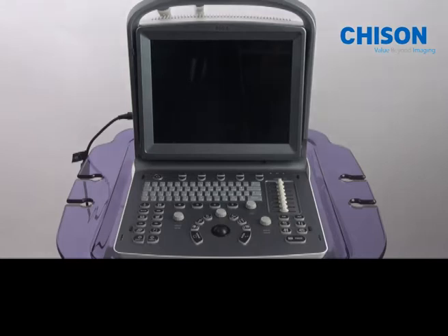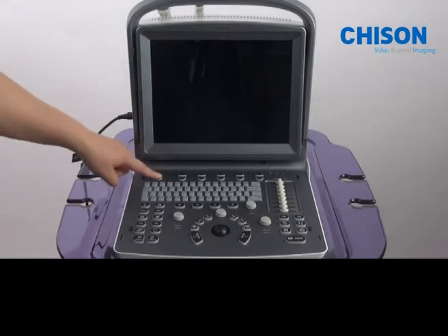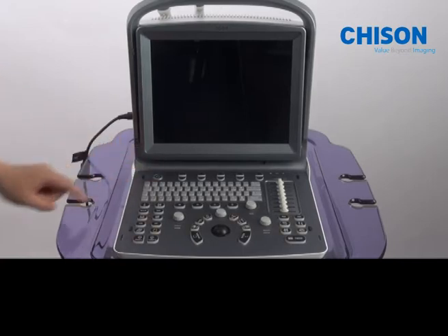Thanks for choosing CHISON ECO6. Now we are going to give you an operation training. Press the power button, hold it for a moment, and the keyboard will light up.